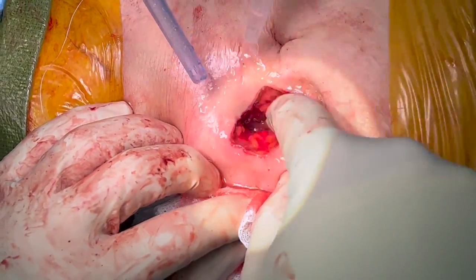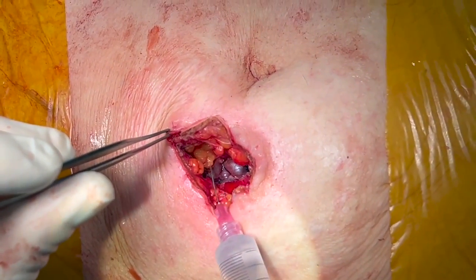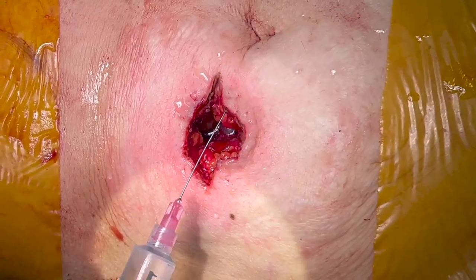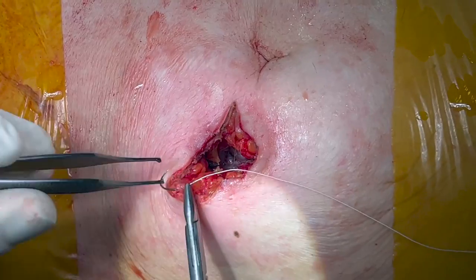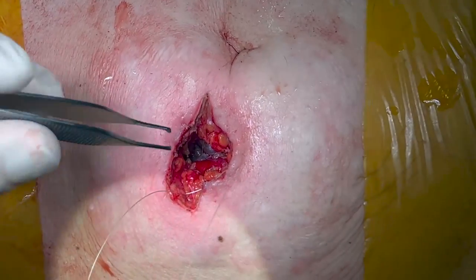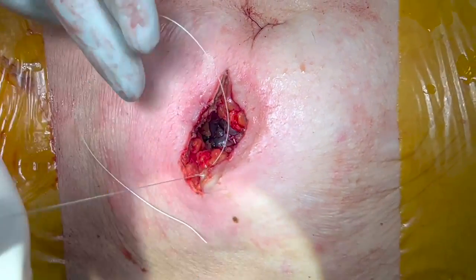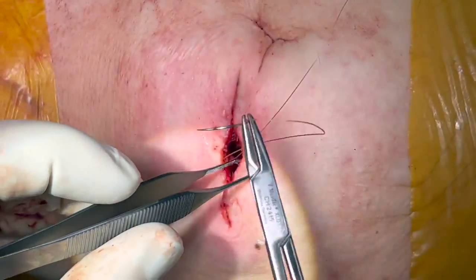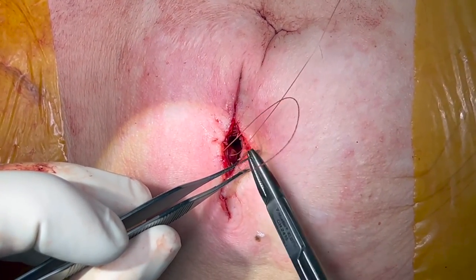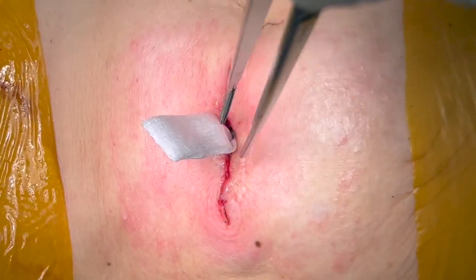The subcutaneous tissue is irrigated before skin closure. Marcaine is used for local infiltration at the fascia and cutaneous levels. Several techniques have been described for skin closure after stoma reversal, including linear closure, purse-string, and closure over a suction drain. In our technique, the subcutaneous tissue is left unapproximated and the skin is closed transversely with interrupted 3-0 absorbable dermal sutures. The middle half-centimeter of the wound is filled with Telfa wick, removed on post-op day number 2.